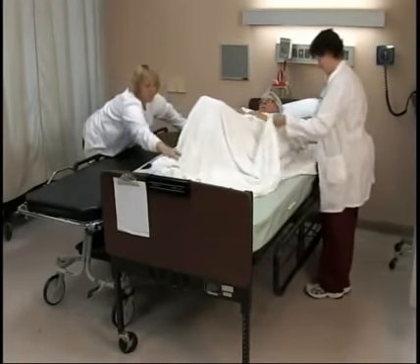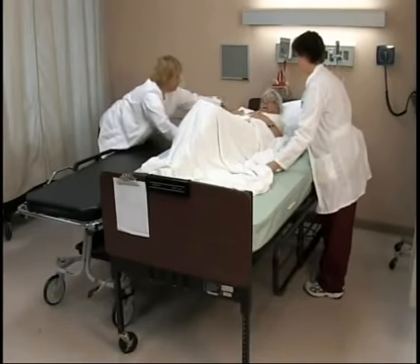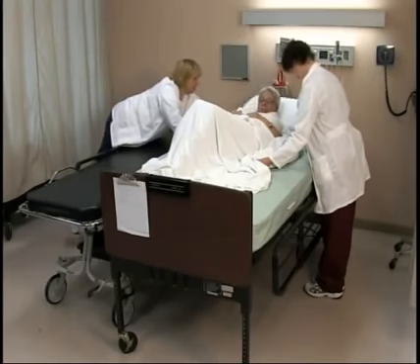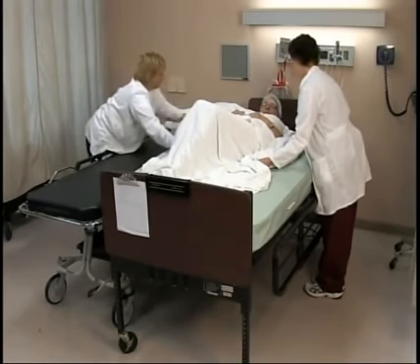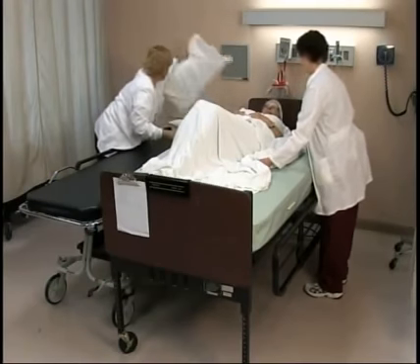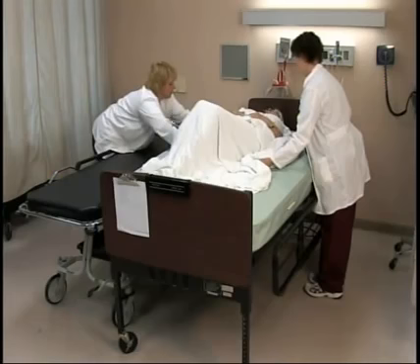Using the sheet, instruct the helpers that on the count of 3 you will slide the patient over the slide board to the stretcher. It may be necessary for the 2 assists on the opposite side of the bed to get onto the bed to help with the move. It is never appropriate to get onto the stretcher to help move a patient.